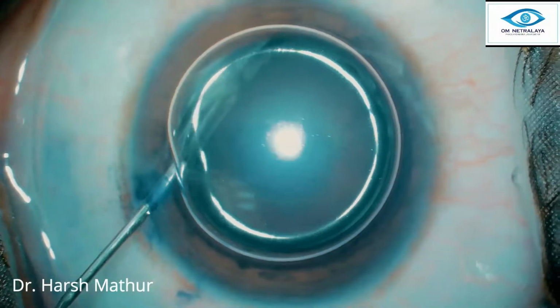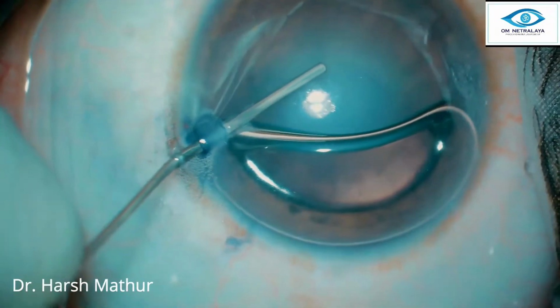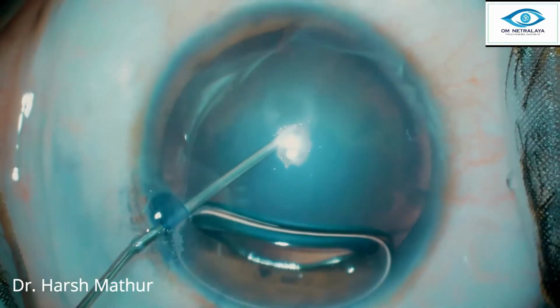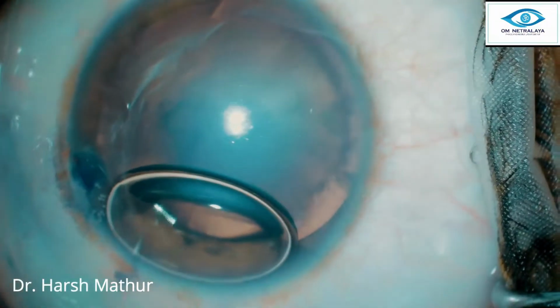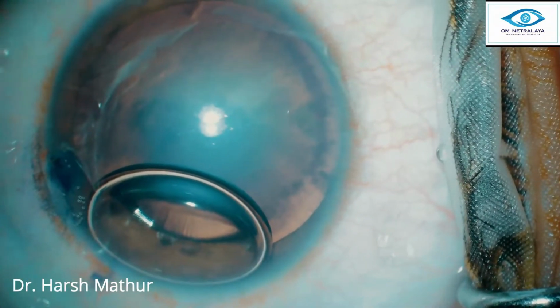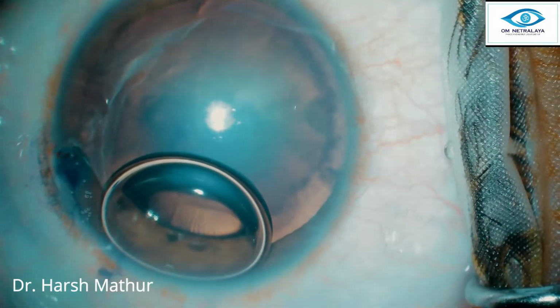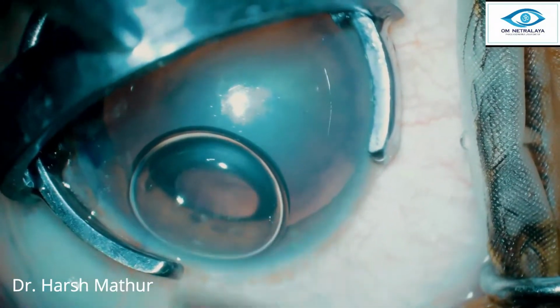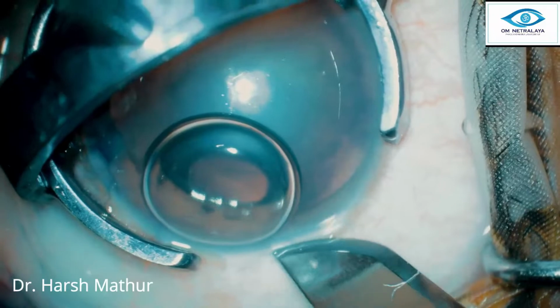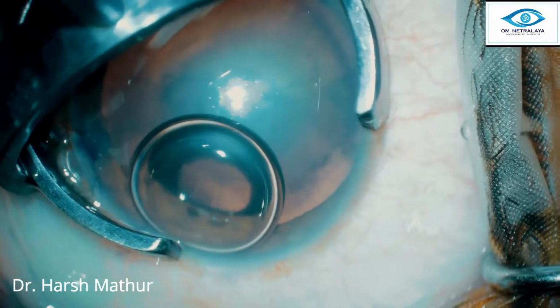So in managing a soft nucleus, there is no fixed dictum. You have to do it somehow. So many surgeons prefer a pre-chopper, some opt for stop and chop, some go for direct chop, some prefer to tilt the nucleus, and some prefer to bring out the nucleus and emulsify it.